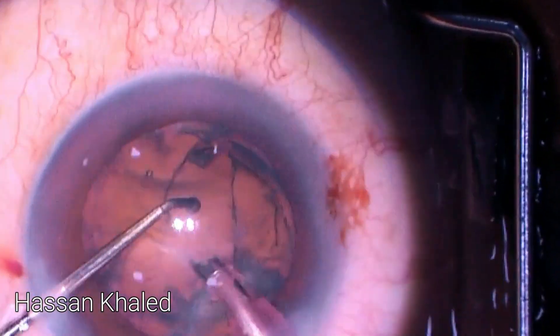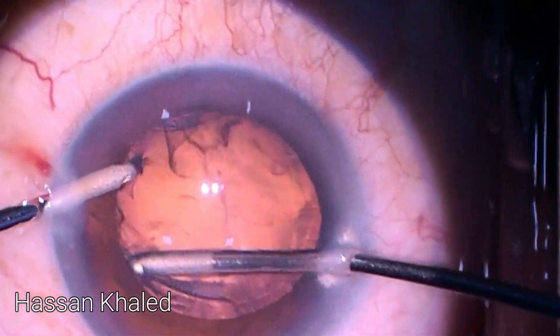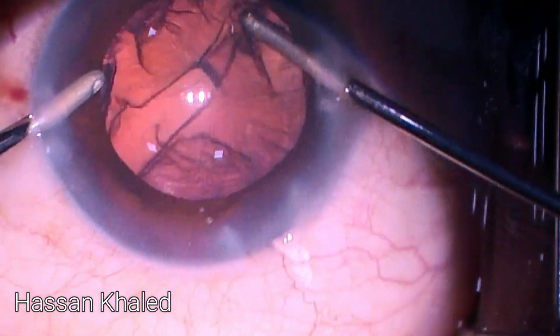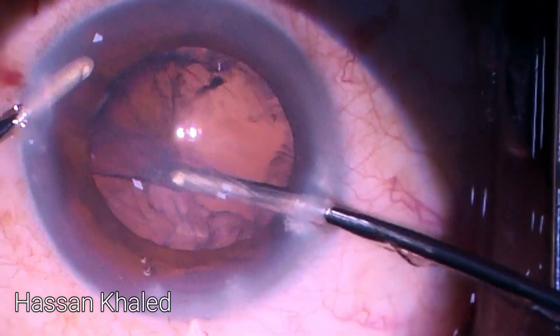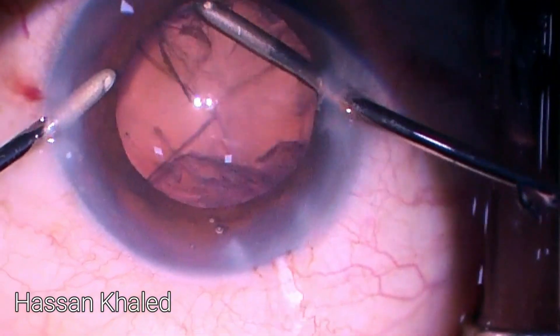Using bimanual irrigation-aspiration, I'm gently aspirating the cortex while keeping the anterior chamber and capsular bag well-formed at all times during cortex removal, as you can see.